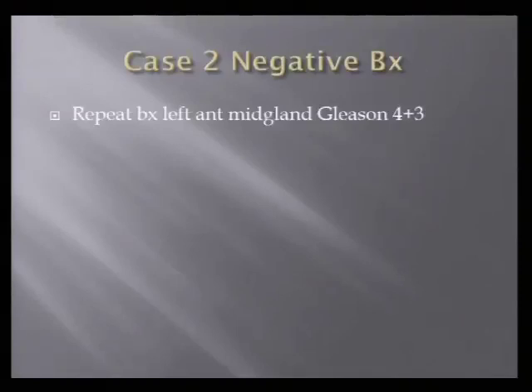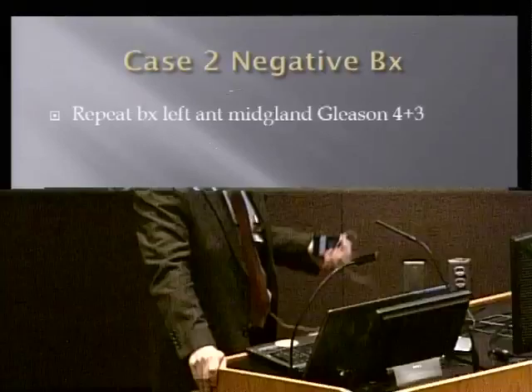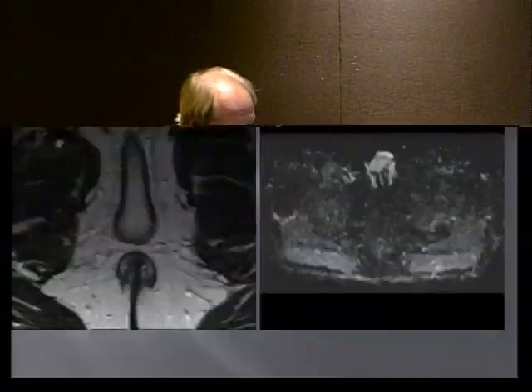So this is exactly what I was talking about when Brad asked that question in tumor board, you know, what do I see as the usefulness? I think there's a lot of debate out there. This one to me is just useful in my opinion. If you have someone that keeps getting negative biopsies and something like this can happen, I think that MR did make a difference in a case like this. There might be arguments against it. I don't know if maybe management could have been done differently. But in this case, I think that it does help.